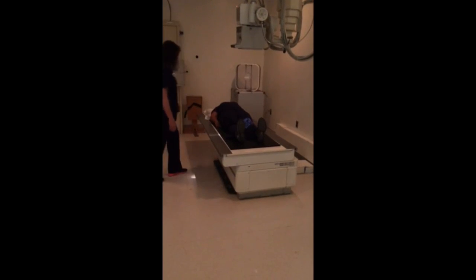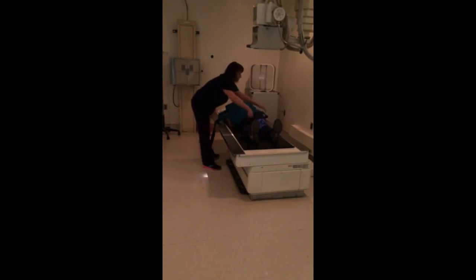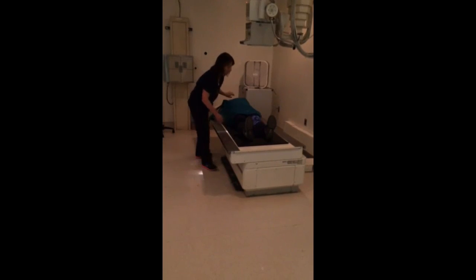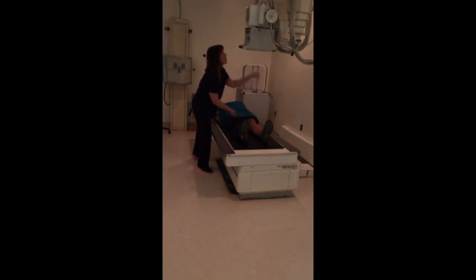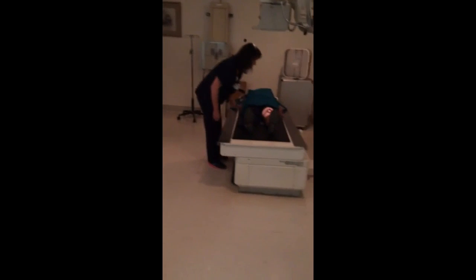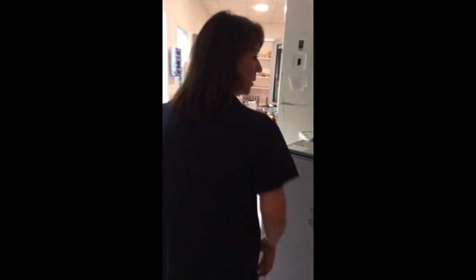Okay. All right, so I'm going to go ahead and shield my patient. Okay, stay real still for me. Okay, 70 at 5 mAs. X-ray.